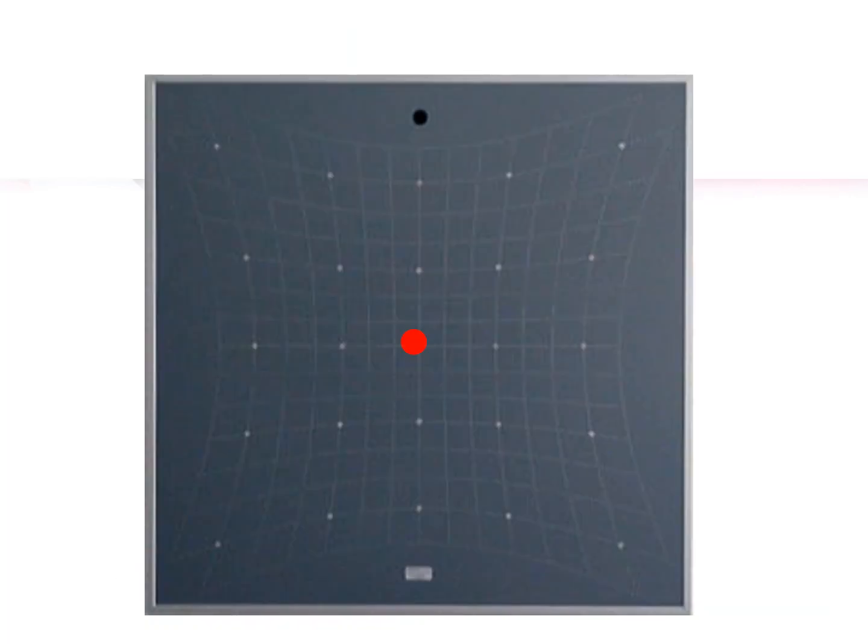We start in the central gaze. A red target is shown in the middle of the screen. The patient is pointing a green light from a special type of torch in his hand called Foster torch. The patient is asked to place his green light over the red light that he sees. The test is then repeated in different directions of gaze.